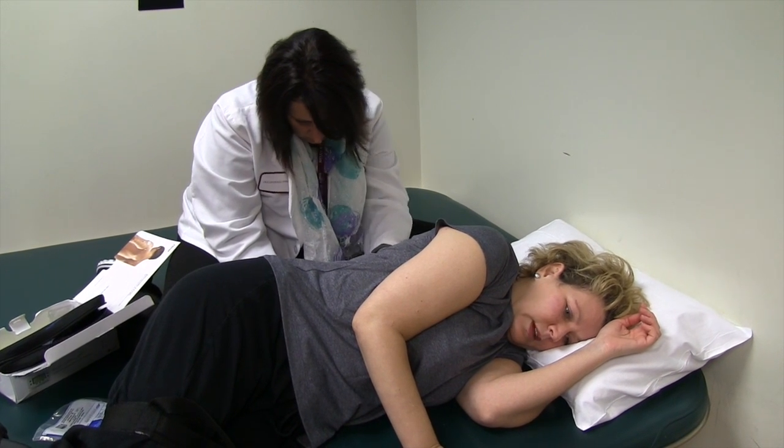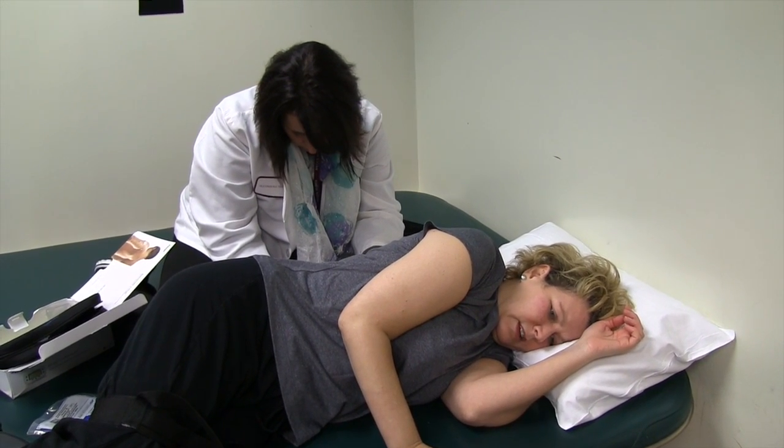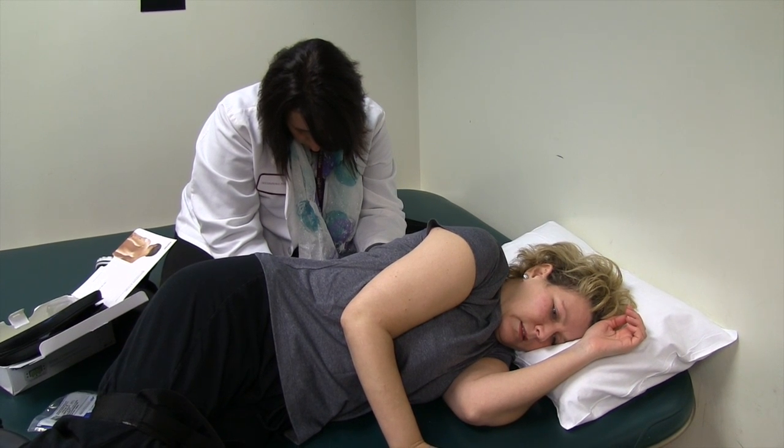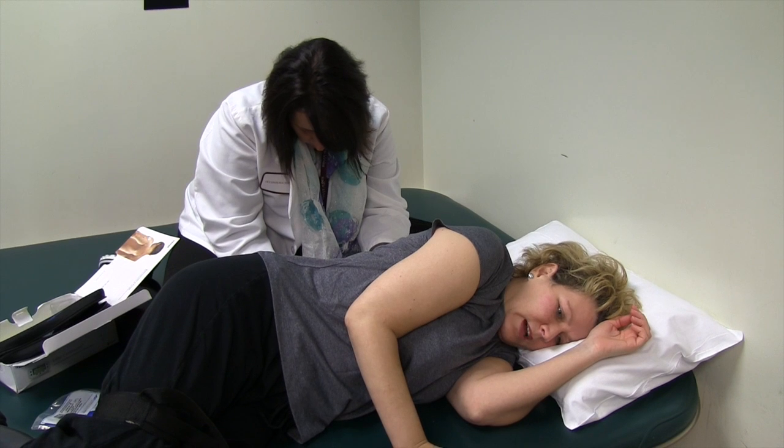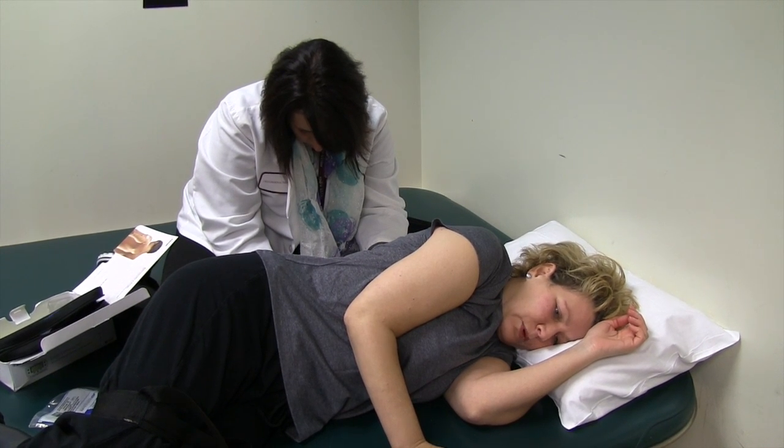Are you feeling it? I am feeling it — feeling it in the top more than the bottom, but feeling it in both top and bottom.